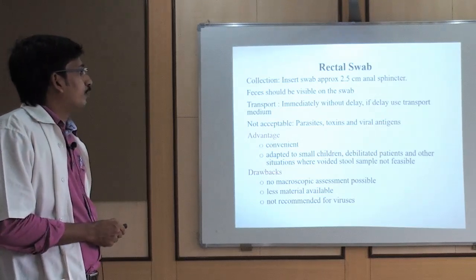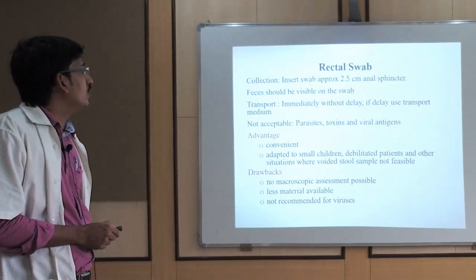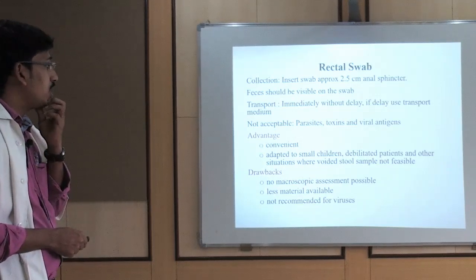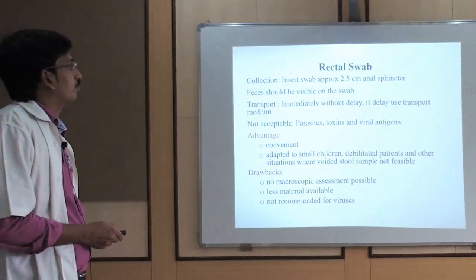It is not suitable for parasite detection, toxin detection and viral agents. It should be used for cultures only, bacterial culture only. And coming to the drawbacks, no macroscopic assessment is possible, less material is available, and it is not recommended for viruses.